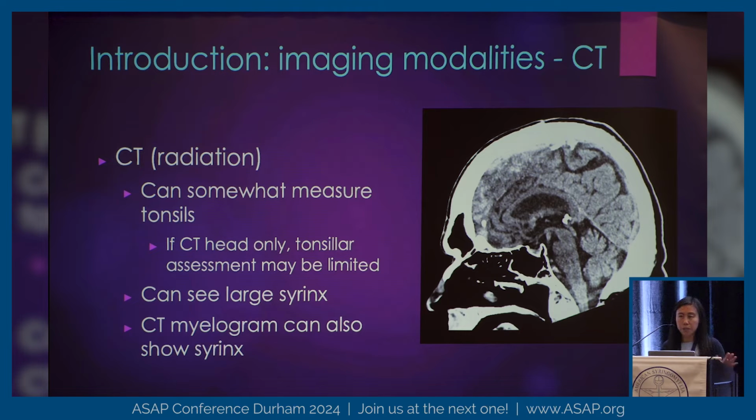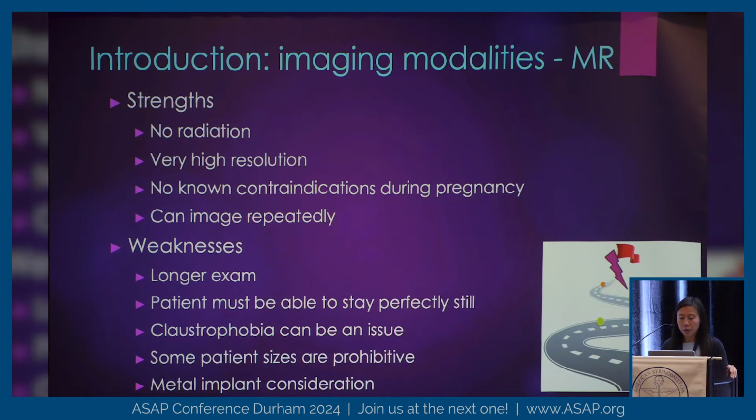But that's obviously an invasive way to look at a myelogram. For someone who really can't undergo MRI, that might be a possibility. So the other option is MRI. There's a lot of things going for MRI.